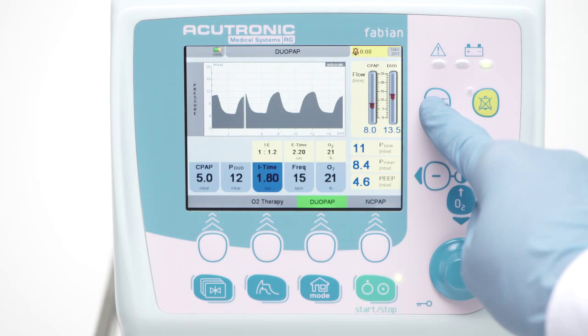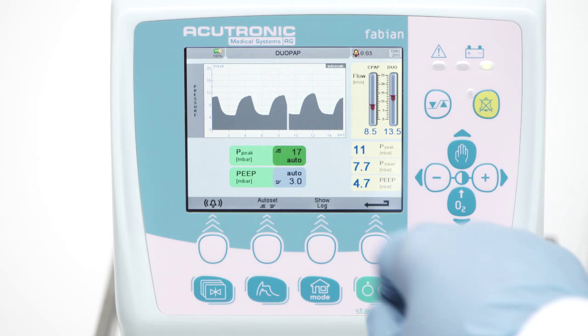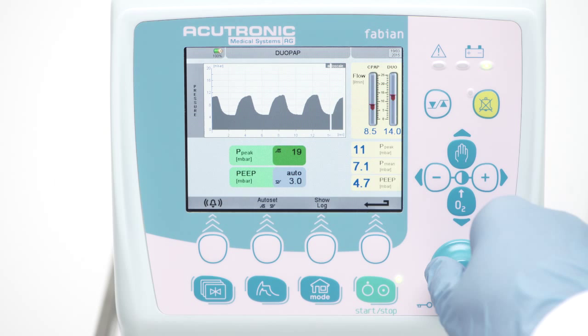Depending on the patient's condition, the limits have to be modified from time to time, manually or with the auto-set button.